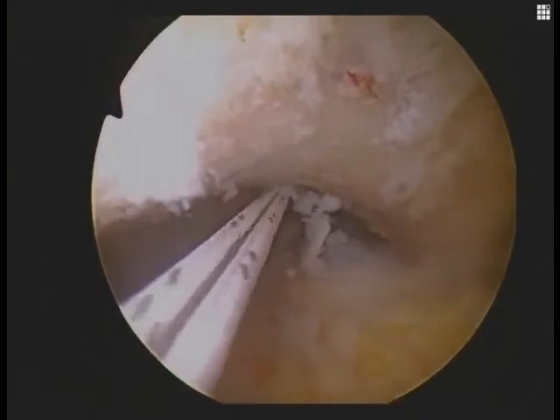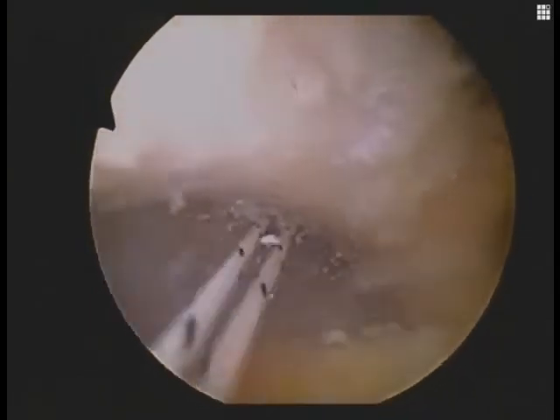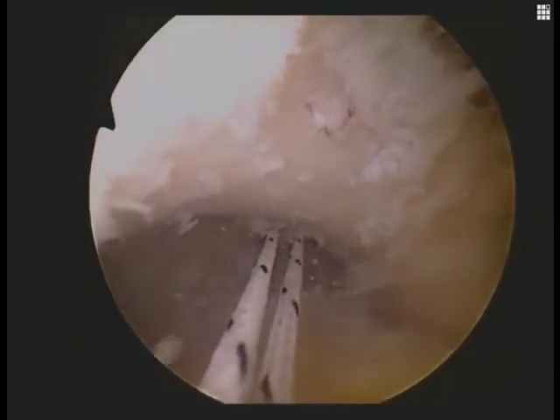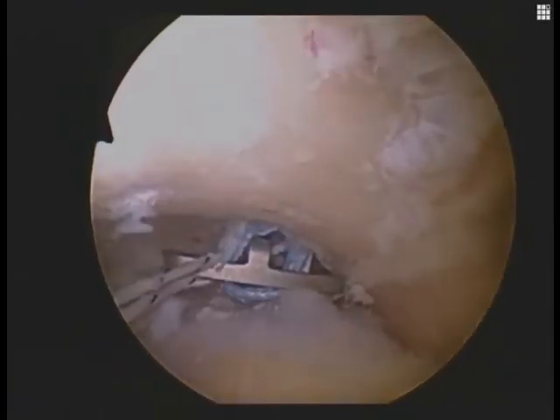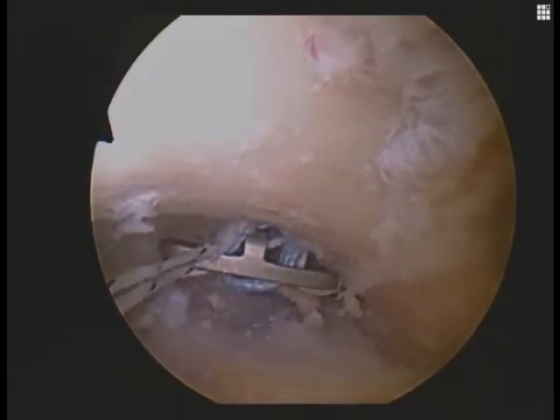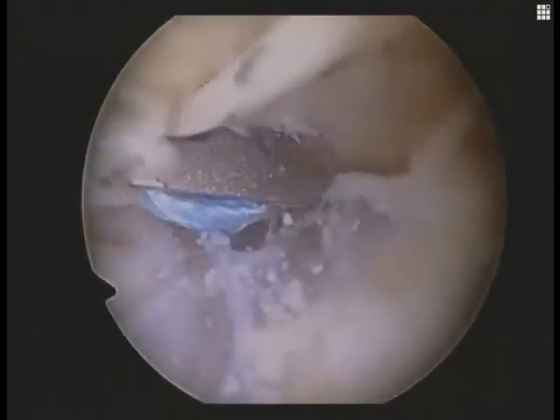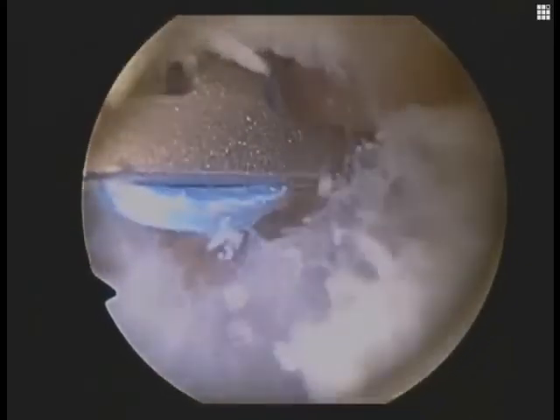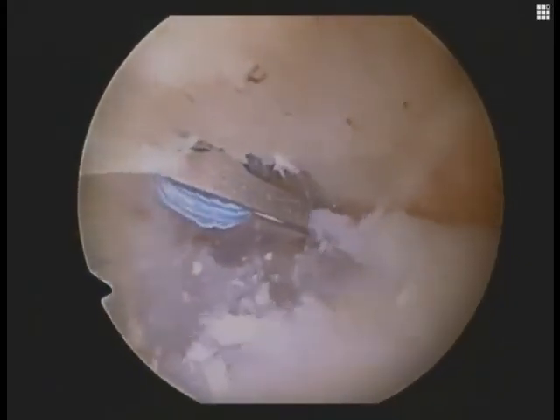We're now ready to deploy the coracoid fixation device, through which a double-looped number five FiberWire suture and a pulley-type system is secured, along with an allograft tibialis anterior for biological reconstruction along with our number five FiberWire. Here we are tightening the construct down through the pulley system with the washer on the clavicle.